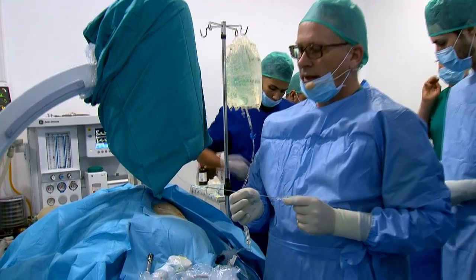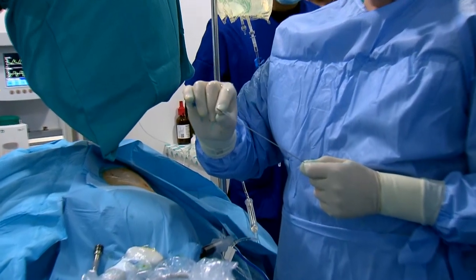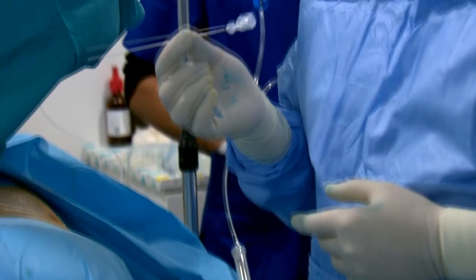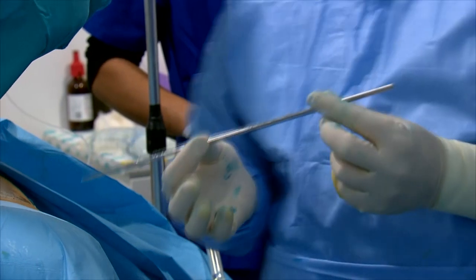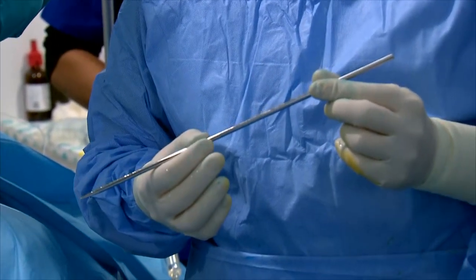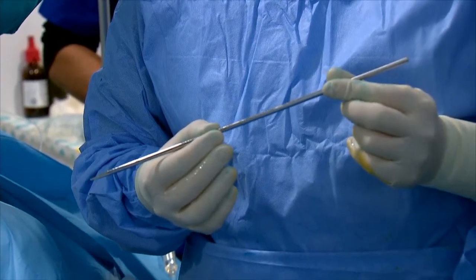This is a puncture needle. It has a special tip, a special material which can be seen better in ultrasound. After we have punctured the kidney, we insert a guide wire, and then we have this special stainless steel dilator. This is a 15 French dilator. It is reusable, very cheap. You can use it over years.